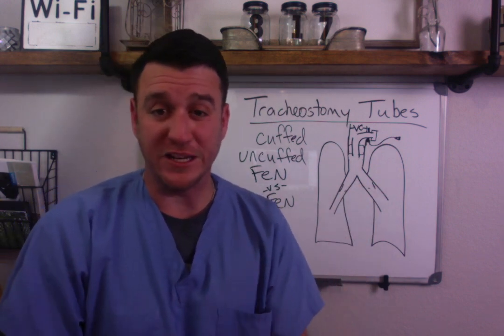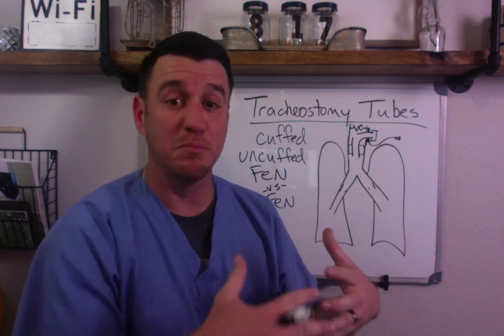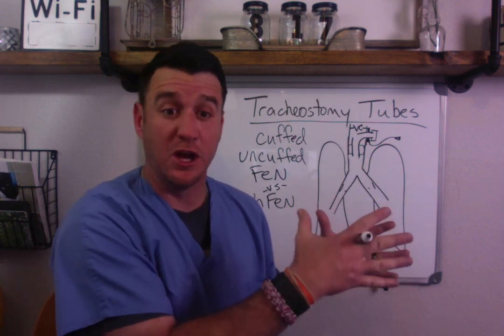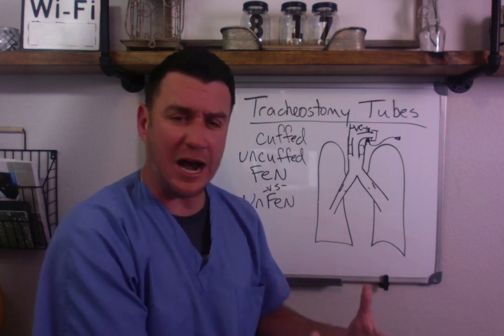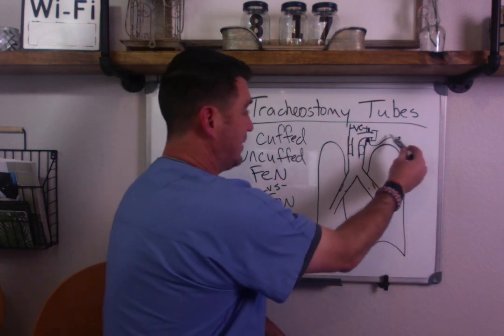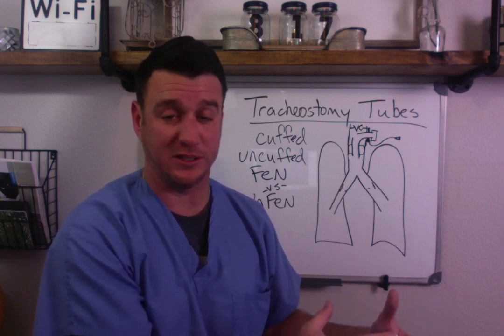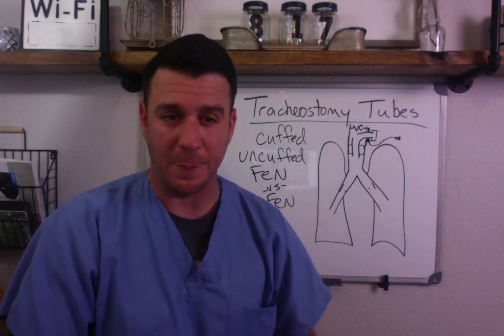The purpose of a fenestrated tracheostomy tube is to promote and enhance more airflow through the upper airways. So obviously we're not talking about a patient who needs mechanical ventilation. If you have a patient who needs mechanical ventilation, you would not want a fenestrated tracheostomy tube, because the air would come in and up and out the fenestration. Instead, you would want a non-fenestrated tracheostomy tube, a trach tube that does not have this hole in it. Now, here's where it gets kind of tricky.